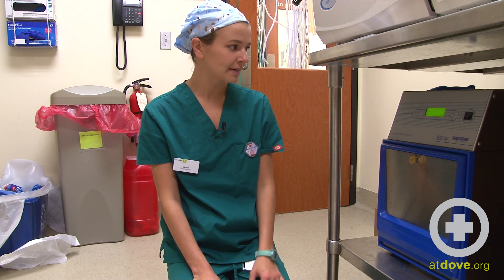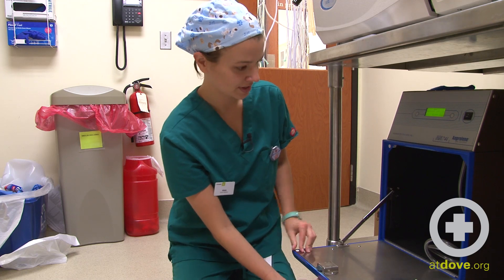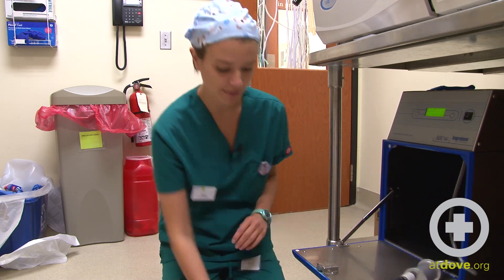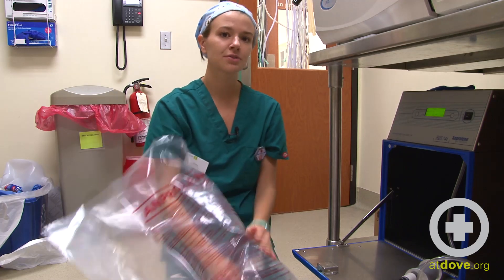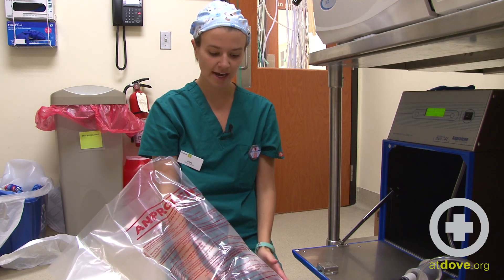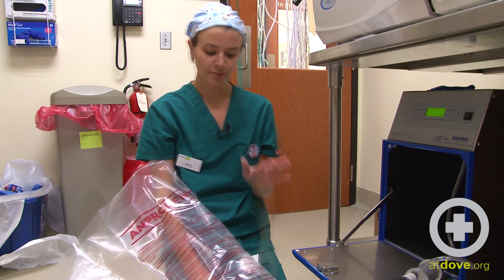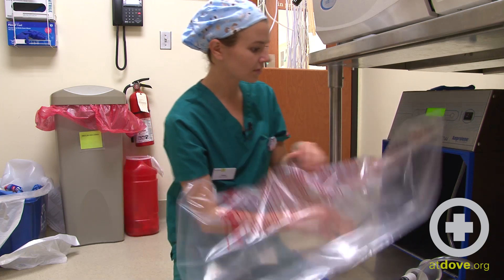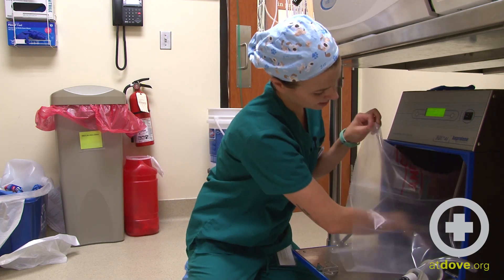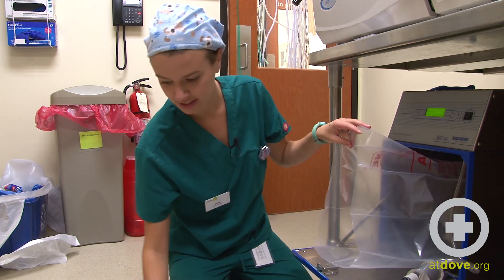So I'm going to turn the sterilizer on, and I'm going to open the sterilizer here, and I can start loading my equipment. The first thing I'll do is I'll open up my bag. I want to make sure that I use a clean, new bag every single time, just in case the previous bag had a puncture in it. I just want to make sure every time I run a load, I'm using a fresh bag. So I'll put that in here, and then I can start to load my items into the bag.